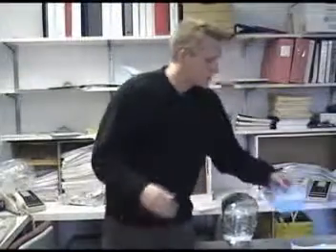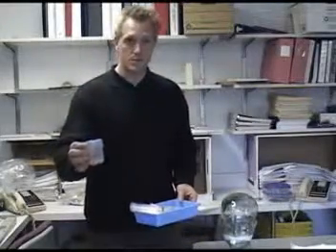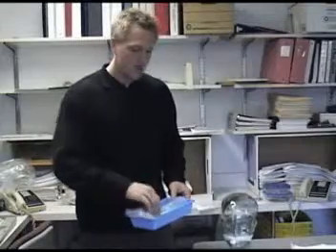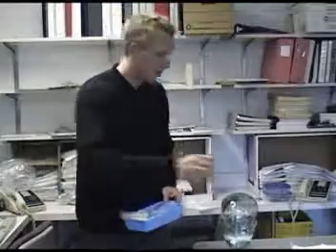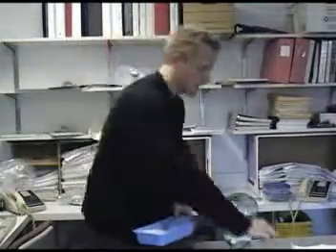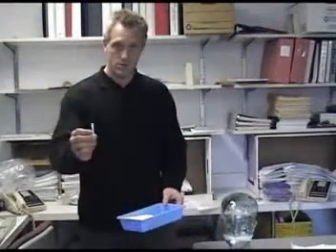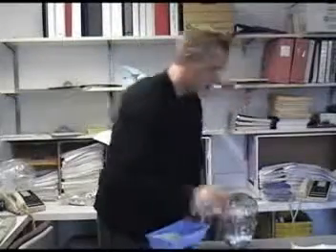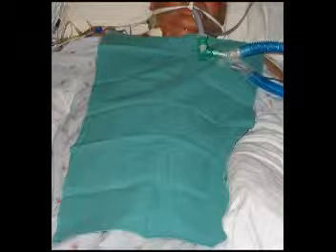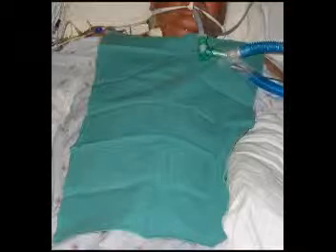In the kit, what you'll find is an airway adapter, the specimen cup, and what you're also going to find are 2 syringes and 2 vials of saline. And I'll go over the reason for that later. Then you're going to have your syringe, which I've already filled up with your saline, specimen cup, which we've already talked about, a needle to remove the saline from this vial, and a drape. This is the drape that you're going to go ahead and place over the patient for creating your quote-unquote sterile field.